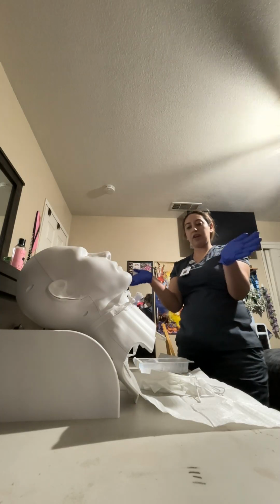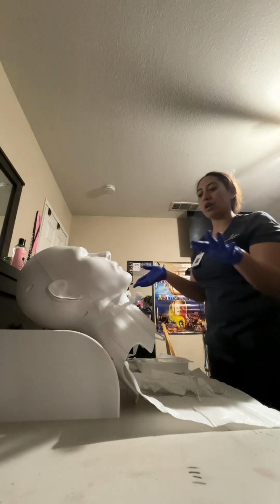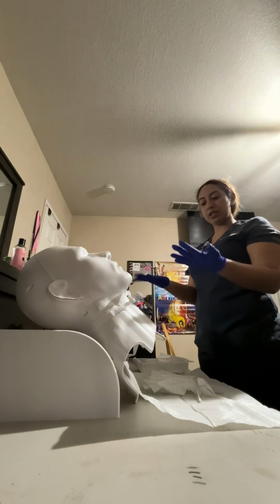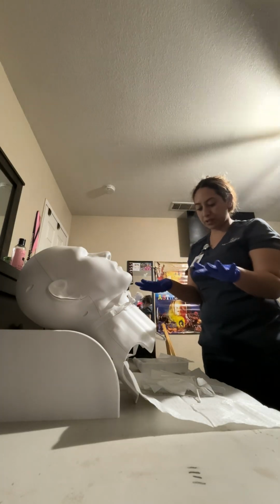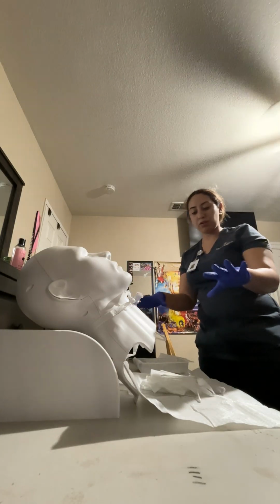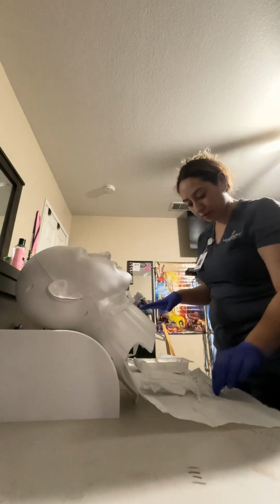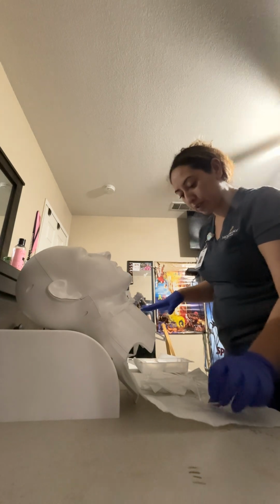Okay, now I have my sterile gloves on. I will make sure that I don't bring them below my waist, as they would no longer be sterile. So I have my sterile field set up. I'm gonna just organize the items here so that way it makes the cleaning easier. So inside I have some pipe cleaners.